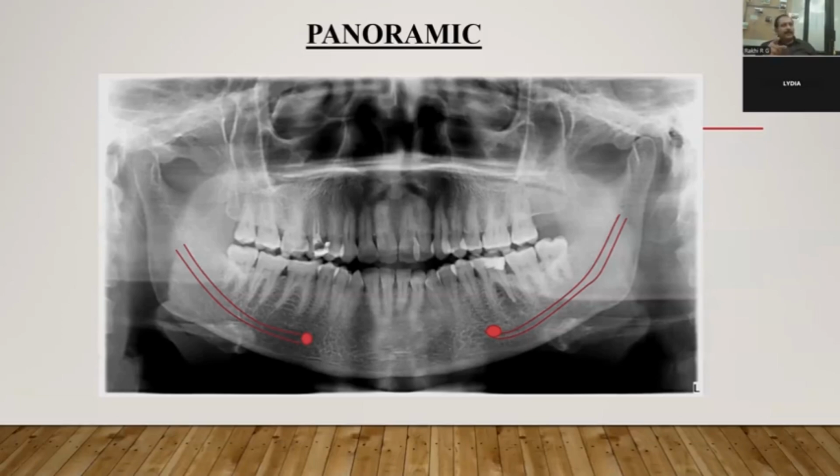If you consider a distal root, replacing it with a lesser diameter implant, then you have to expect some amount of jumping space here. Jumping space means a space between the socket wall and the implant. The potential dead space has to be augmented with bone substitute. And here again, the apical area is not going to be supportive in giving you enough primary stability. So length has to be more, because since you're planning for a lesser diameter implant, primary stability will be lesser compared to the socket size. The apical area is not favorable for primary stability since it has a lesion there.